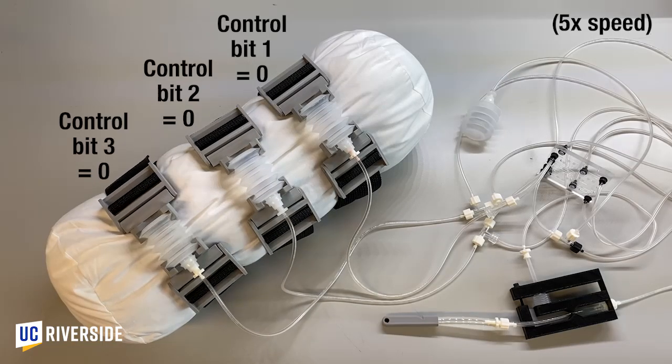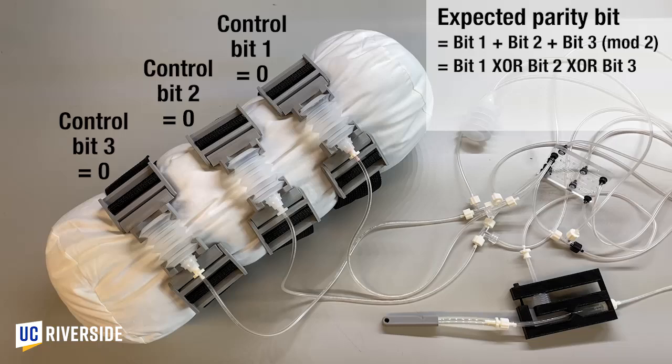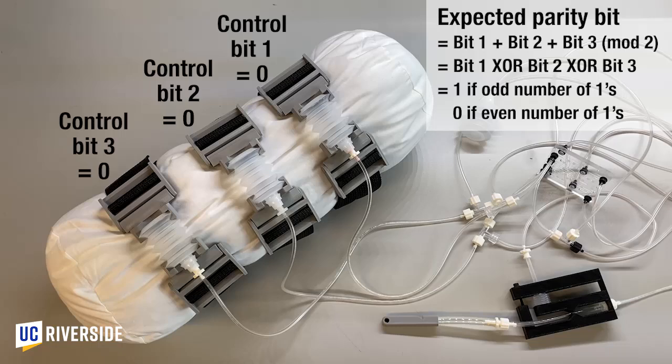The control hardware also calculates and transmits the pneumatic value of an expected parity bit. The value of the expected parity bit is the sum of the control bits modulo 2. This is the same as calculating the exclusive OR or XOR of the control bits. Or in other words, the expected parity bit is 1 if there is an odd number of 1s in the control bits, and the expected parity bit is 0 if there's an even number of 1s in the control bits.